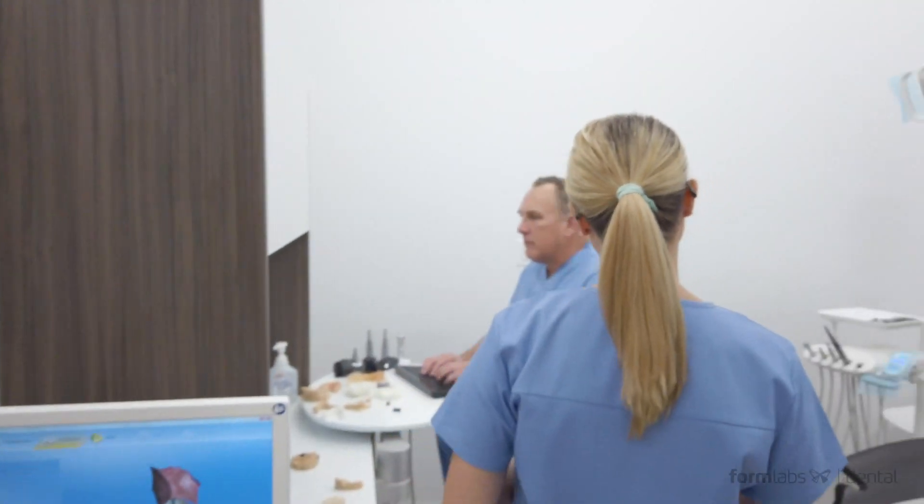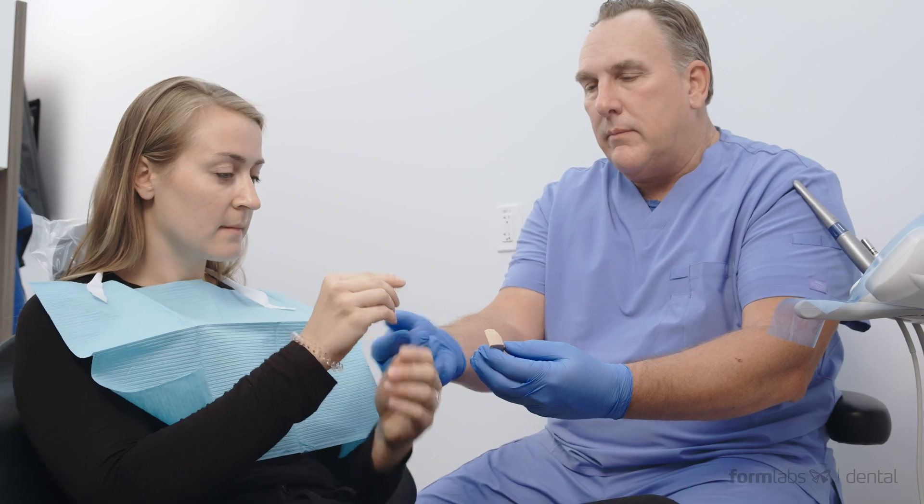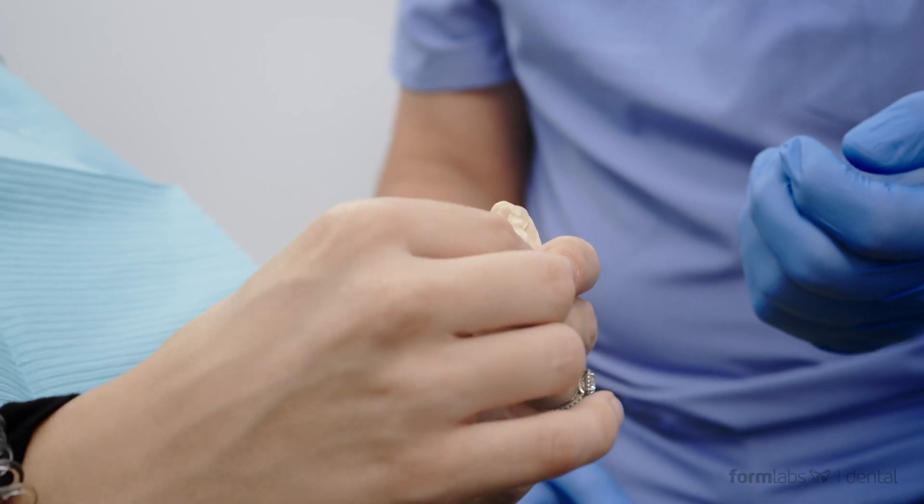The Form Wash and Form Cure integrate perfectly with the Form 3B and make washing and curing printed parts a no-brainer. Optimized settings for each material take the guesswork out of post-processing, leading to a streamlined end-to-end solution.